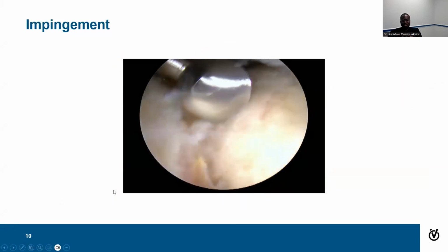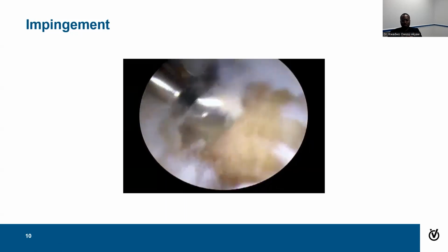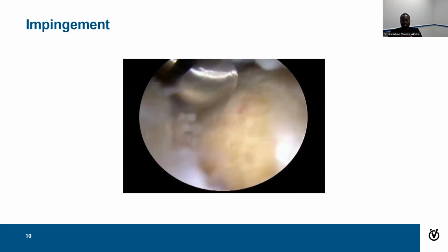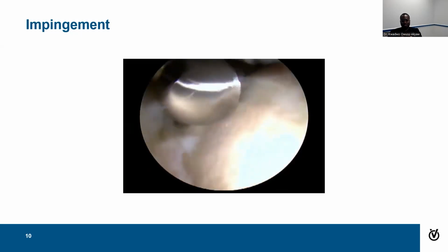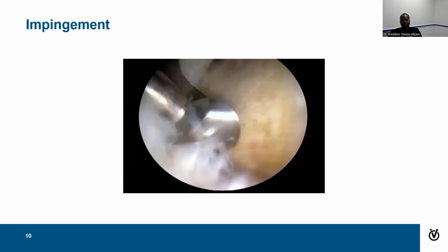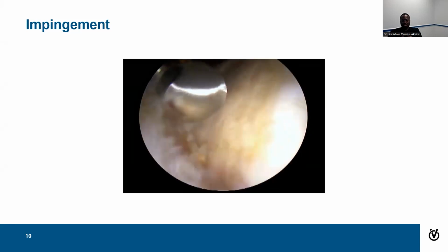So when we're doing this, it's literally us taking what looks almost like something used to sandpaper something, and we just grind it down. So that's me in the process of going around and smoothing out the bone, grinding it down. And it's really meticulous work, and we check x-rays while we're doing surgery to make sure we're doing it properly.